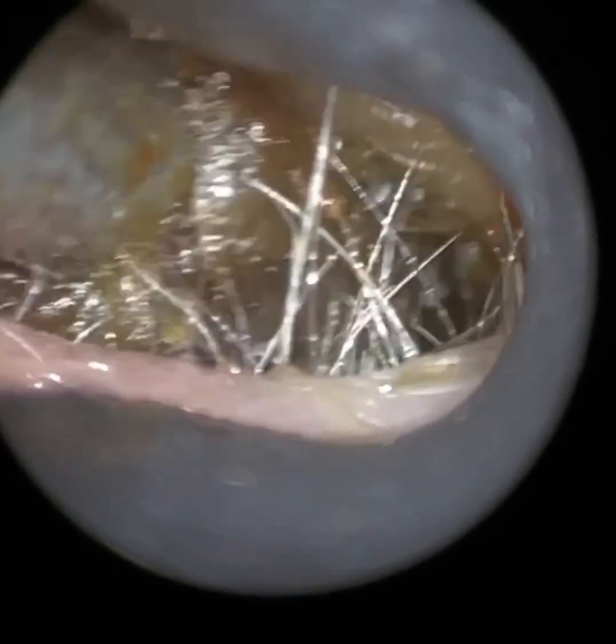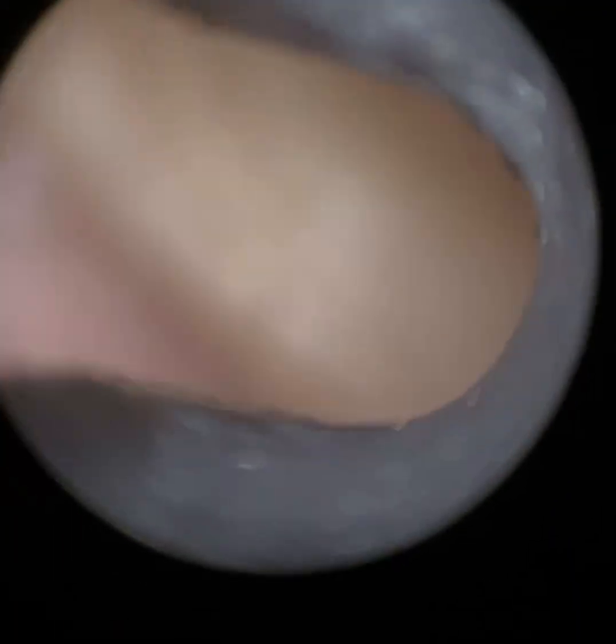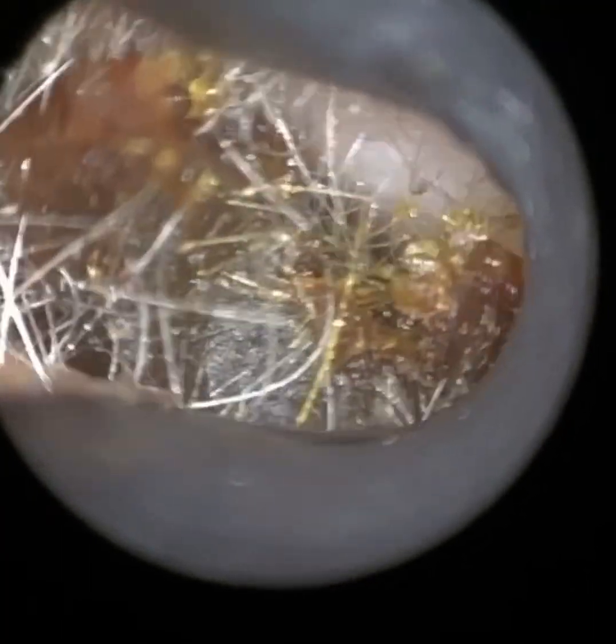We're hoping with the final finish of the speculum — because with injection moulding it's a bit more precise — even with the smaller speculum like this, you'll see possibly slightly less of the speculum in view. And it's going to be more of a jet black finish, more like your standard speculums used for earwax removal such as the Shea, Tamarkin, or Gruber.